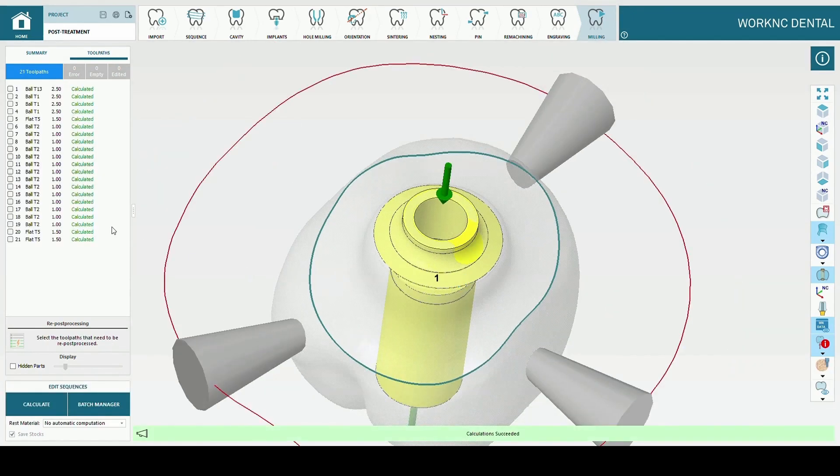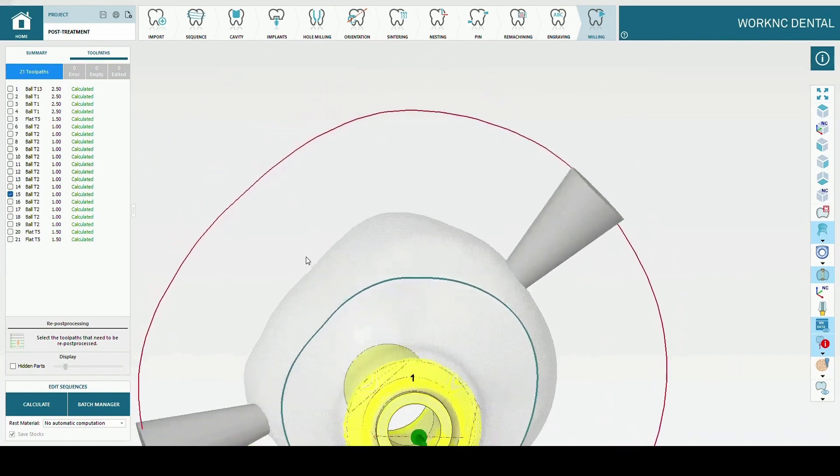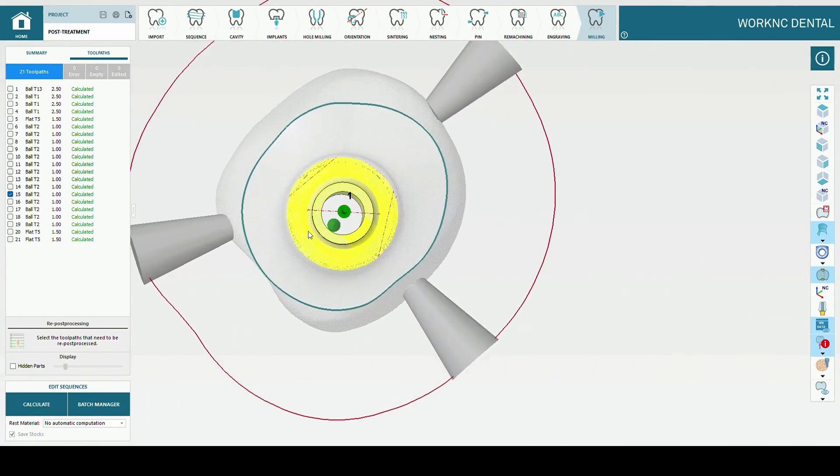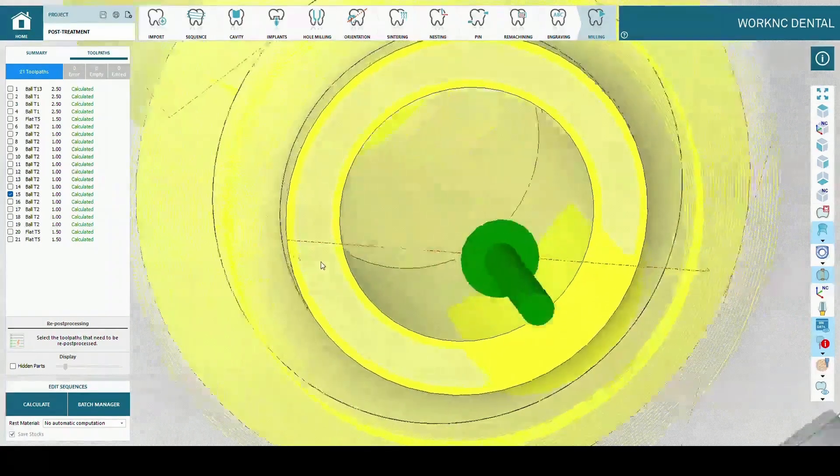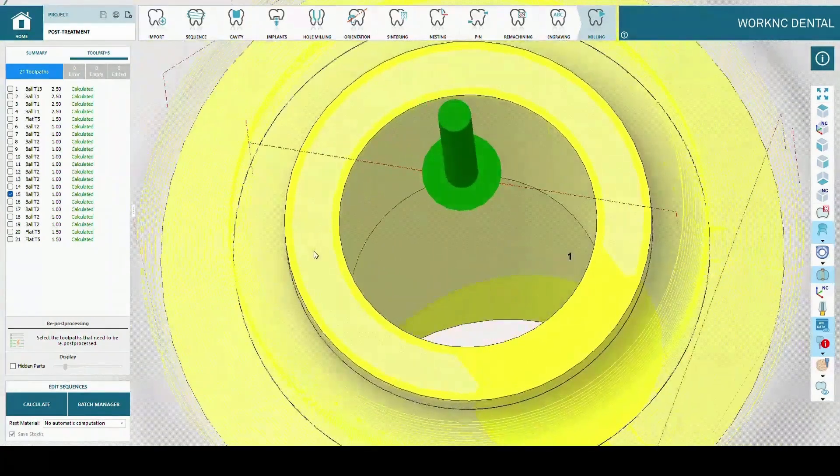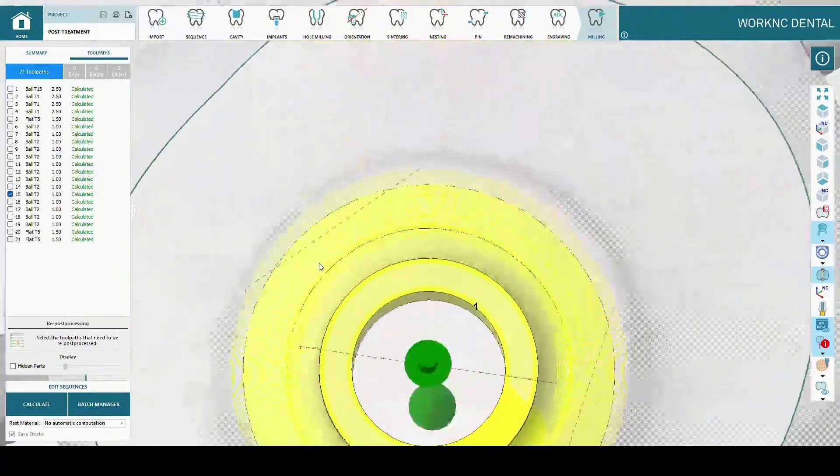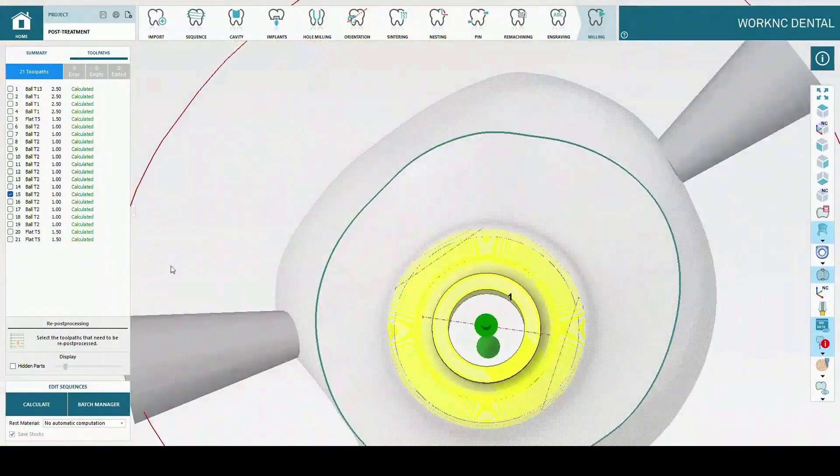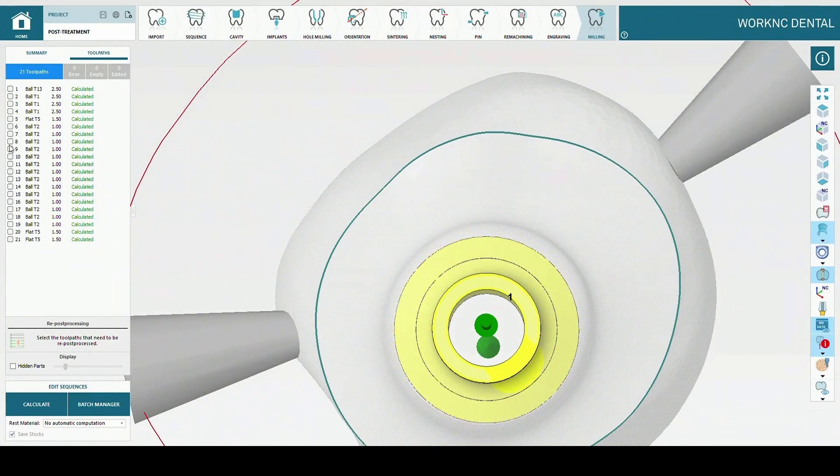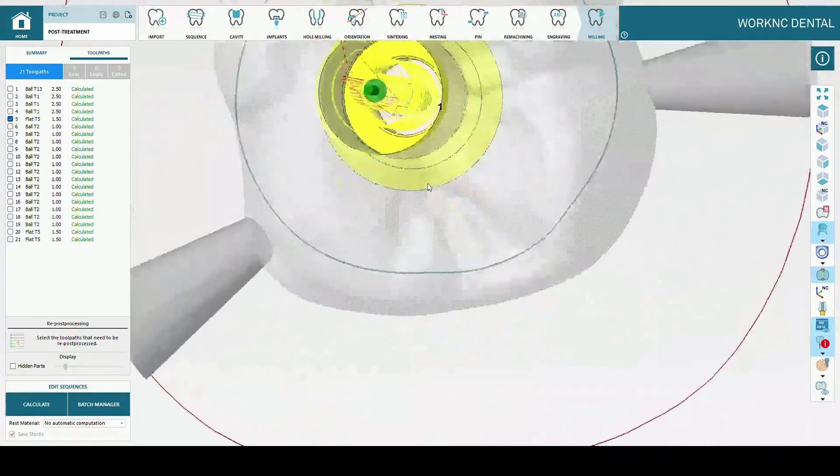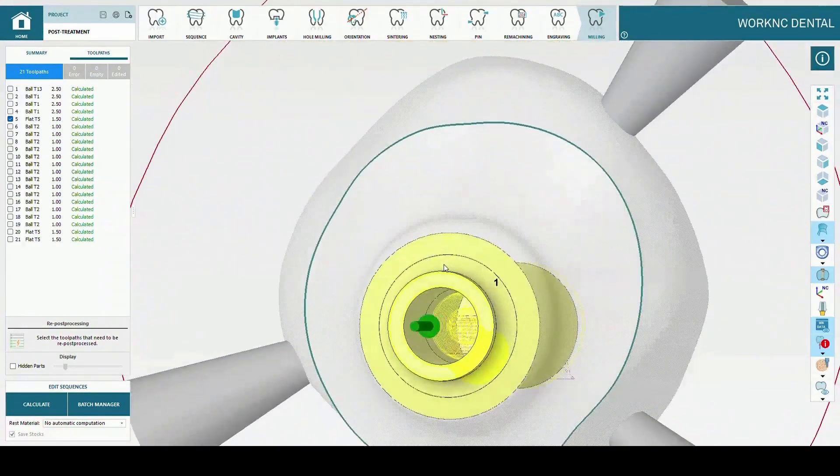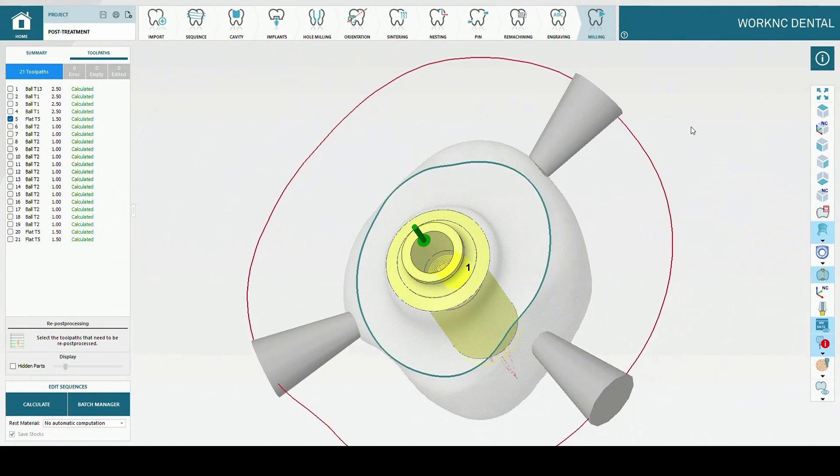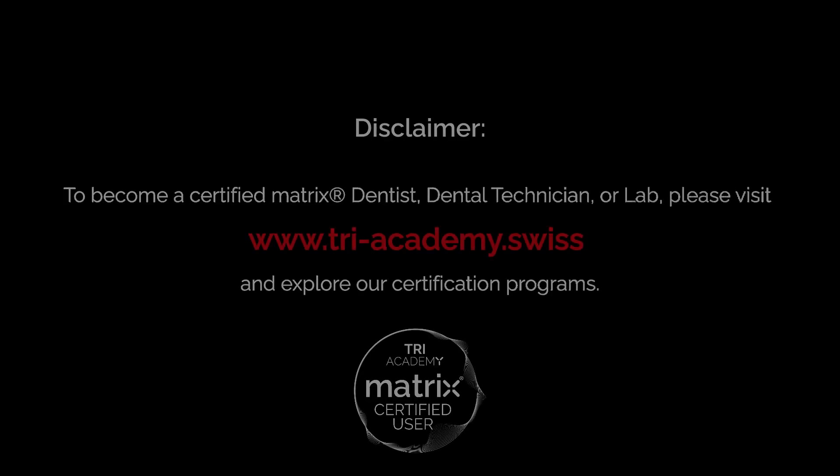Once calculation is finished, you can check the toolpath to verify that the movement of the tool is concentric and according to expectations. Thank you.